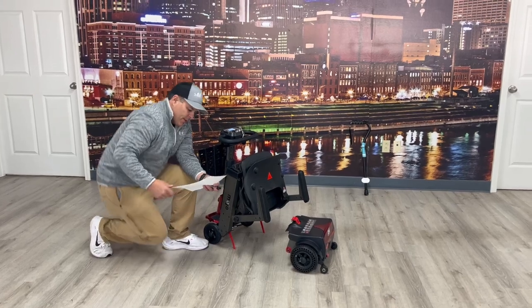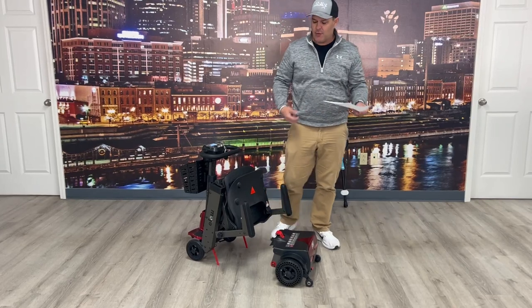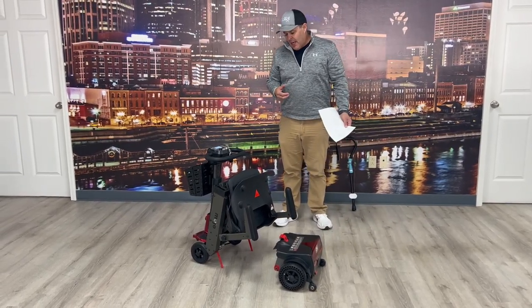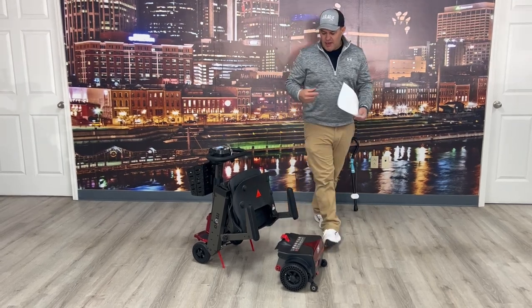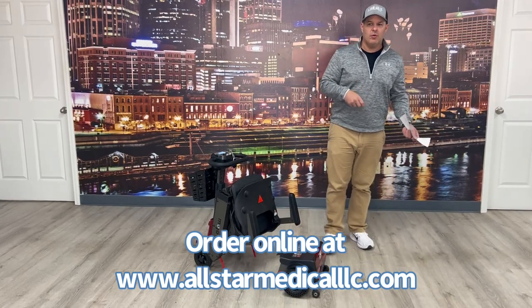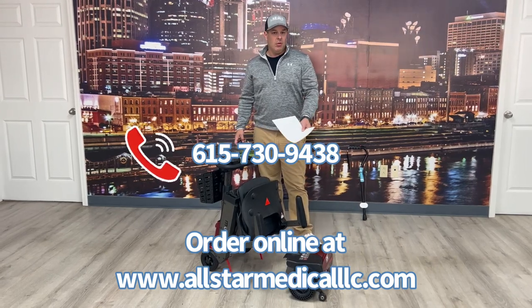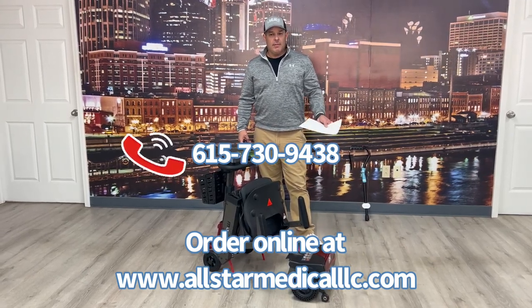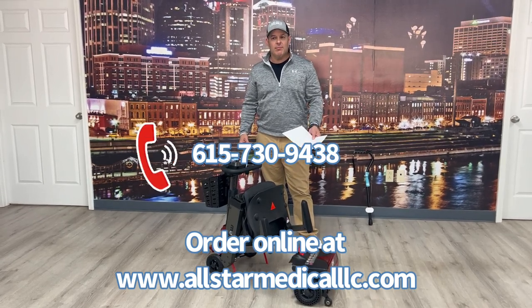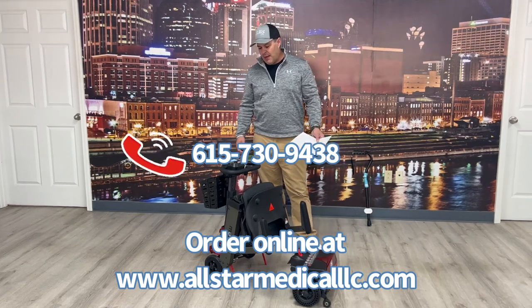You get that 300-pound weight capacity on an auto-folding, which is unique. Enhanced Mobility has done a great job with this — I think it will sell a lot. If you have questions you can reach us at All-Star Medical at 615-730-9438, or order online at allstarmedicalllc.com. Any questions or comments, just comment down below the video. We appreciate your time and have a great day.